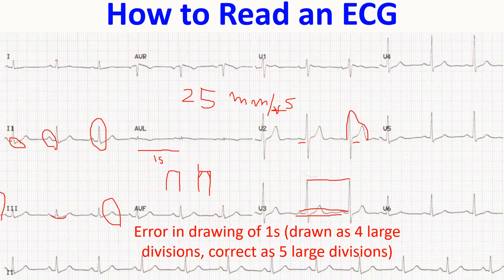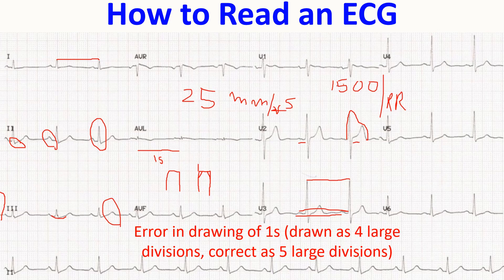If you measure the RR interval and divide 1500 by that value — since at 25 millimeters per second, 1500 small squares equals one minute — dividing 1500 by the RR interval (in small squares) gives you the heart rate in beats per minute. That is how you calculate the heart rate on an ECG.